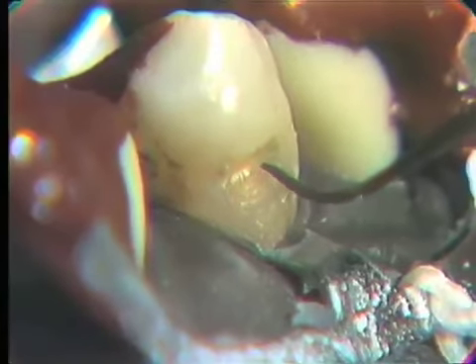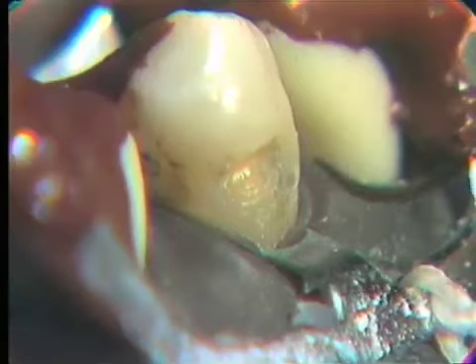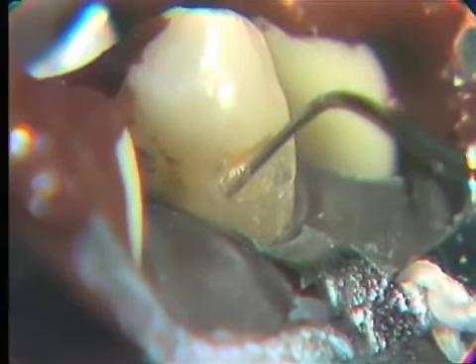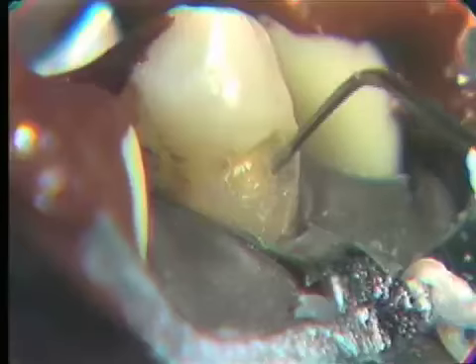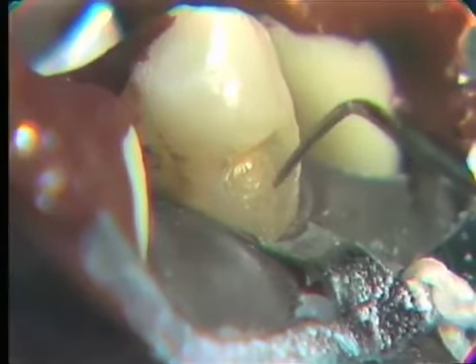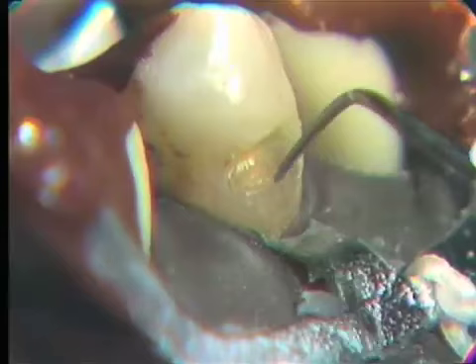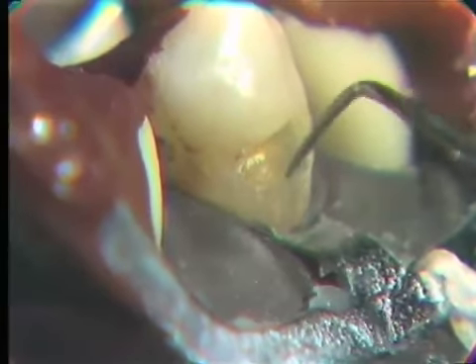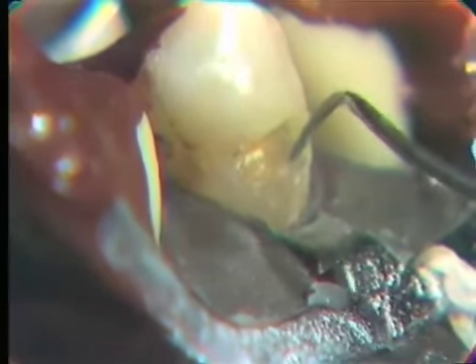penetrated. We have established a retention groove at the cervical, seemingly somewhat hard perhaps to visualize or to see, but I think that one needs to have tactile sense and visual perception of these things, and actually you can see and feel the cervical groove.